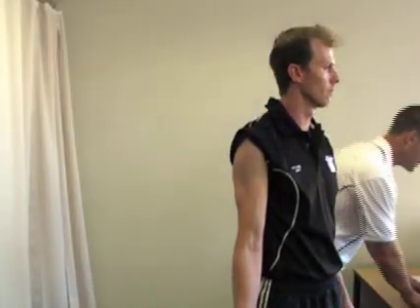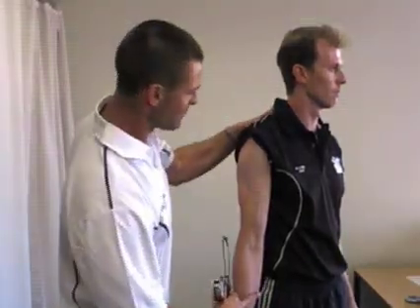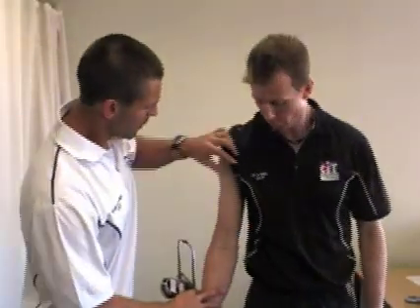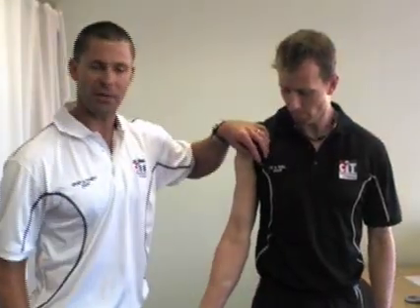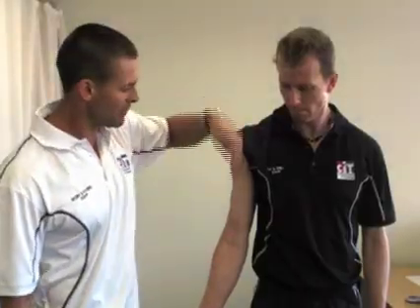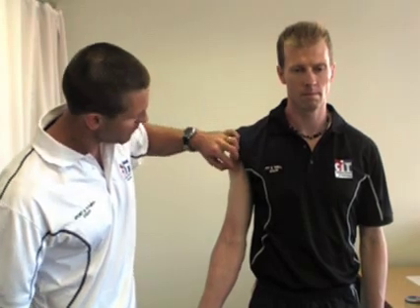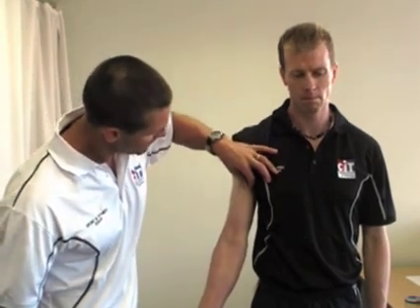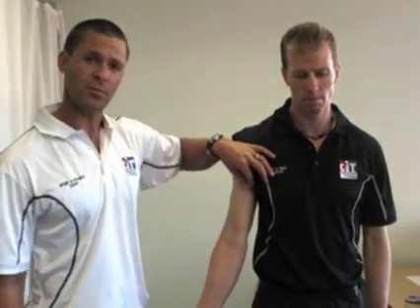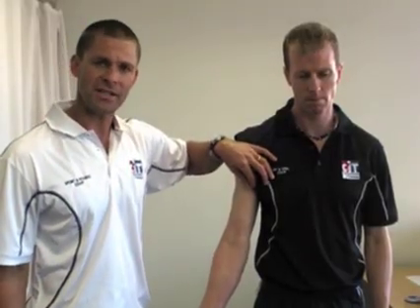Once we've made those two marks, for the bicep we want to ensure that we take a vertical fold that is parallel to and in line with the actual bicep muscle. Where that mark is, we simply go ahead and pinch the skin, making sure that when you pinch the skin you don't grab the actual muscle at the same time.